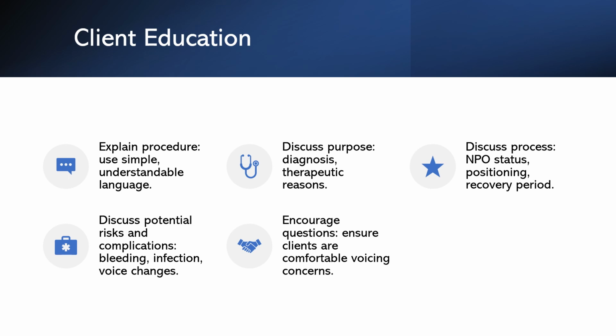They may be sedated to make them comfortable. We need to explain why the procedure is being done, whether we're diagnosing a condition or having therapeutic reasons. We need to reassure the client this procedure is essential to manage their health. We also need to talk about what to expect before, during, and after the procedure.